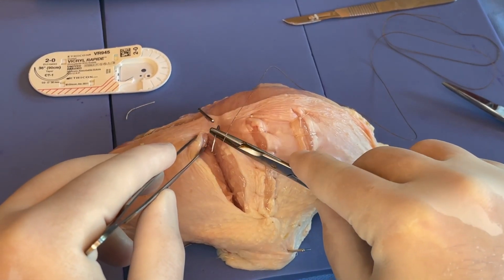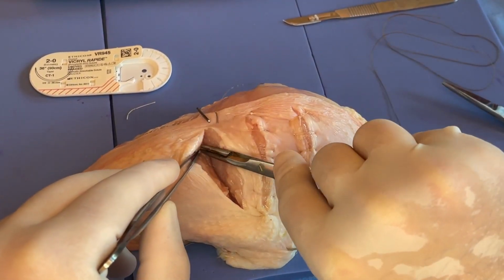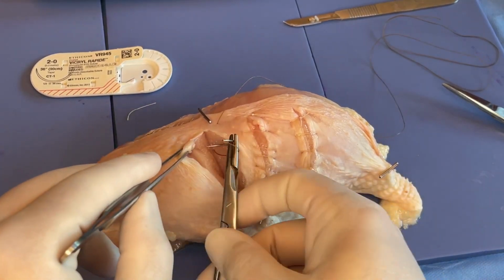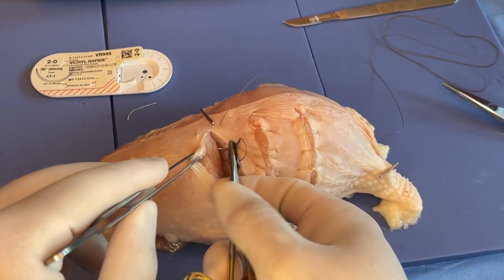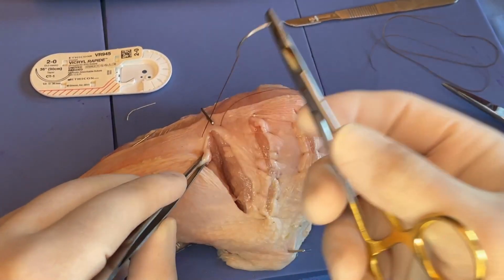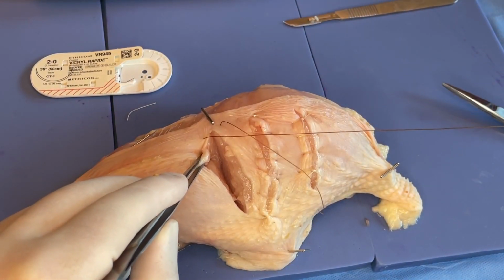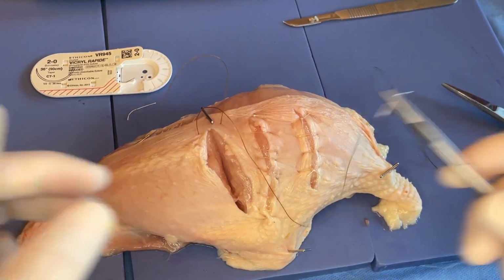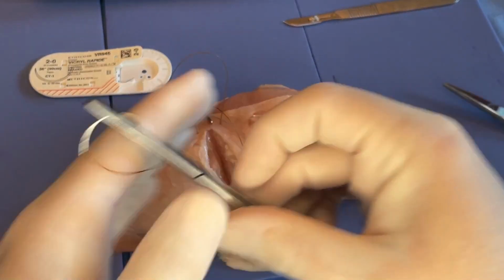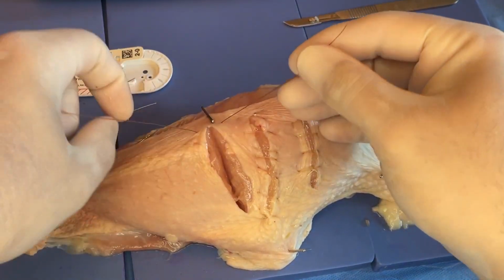So we're going to come up beyond, come out in the middle, reload here at the tissue, go down to full depth, pop out just beyond apex there. So when chromic is wet, it does pull through the tissue fairly easily. Going to protect our needle there. Needle is down protected, and again, two-handed knot here.